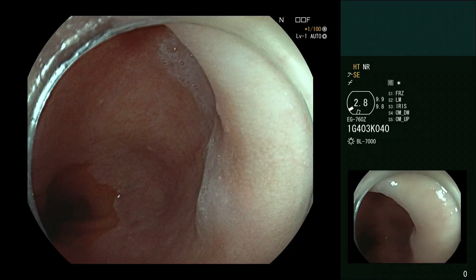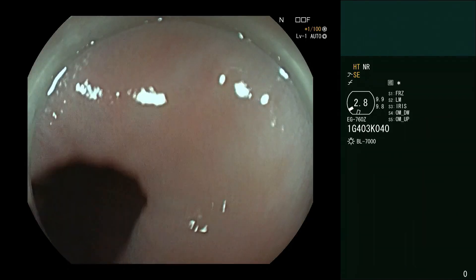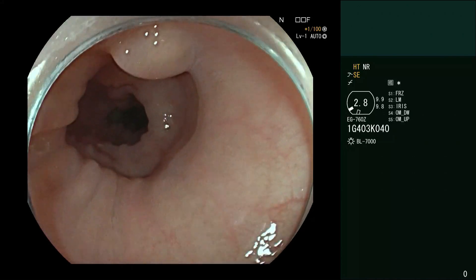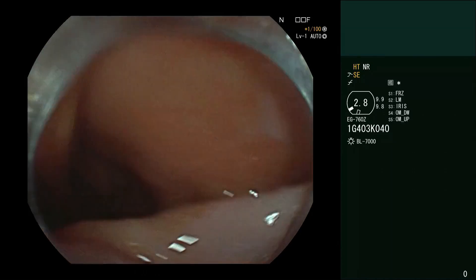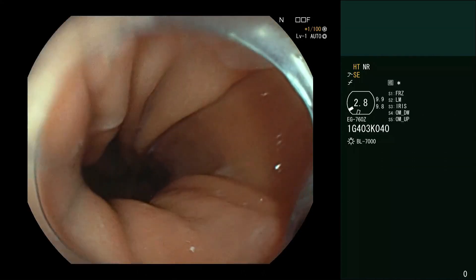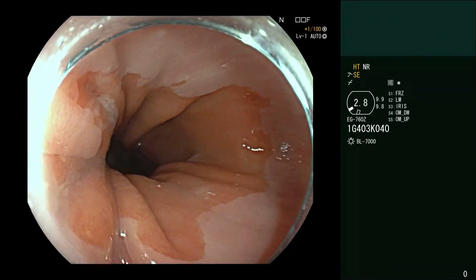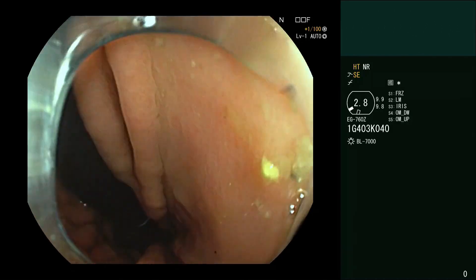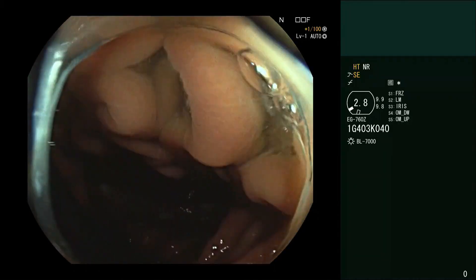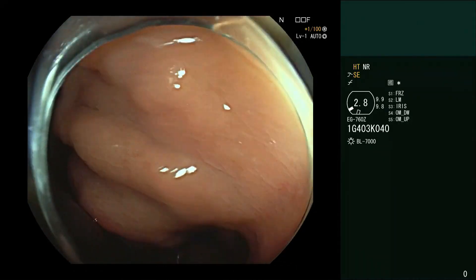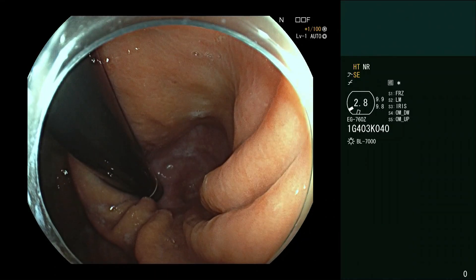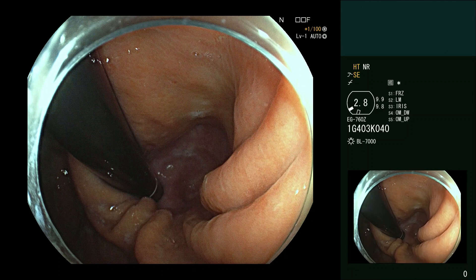You do see here some stasis of saliva. This is very common in patients with achalasia, even when treated, because of the aperistaltic component. Further, we can also see that this junction looks open. We don't attach too much to that, but we can go into the stomach and then retroflex the scope to come and look up at the junction. This endoscope very nicely retroflexes, and we can take a freeze view underneath the gastroesophageal junction.